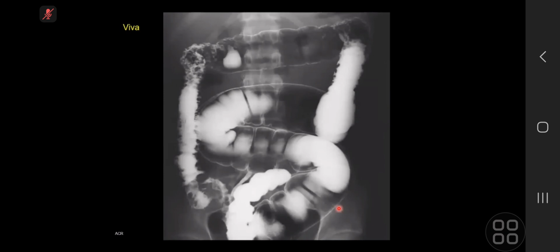There's also some aphthoid ulcer as well, if I can see, especially in the distal transverse colon and the splenic flexure. Appearances extend to the distal terminal ileum, so the distal terminal ileum is a bit narrowed as well. So what is your conclusion? The appearances are quite suggestive of inflammatory bowel disease with terminal ileitis.